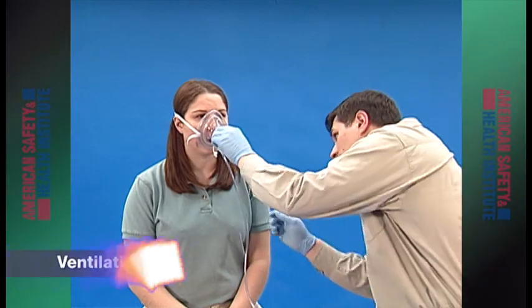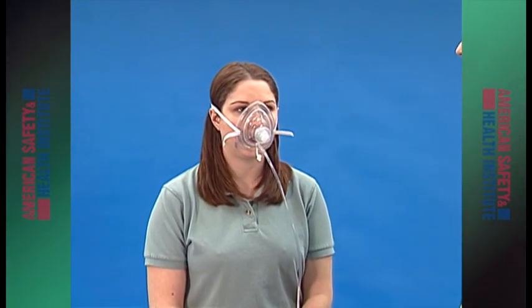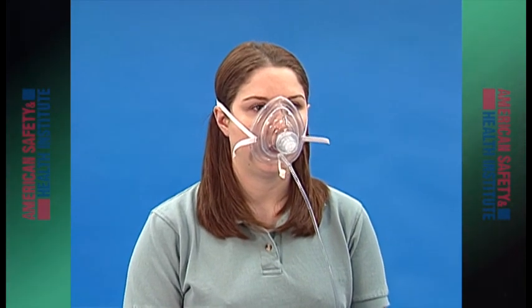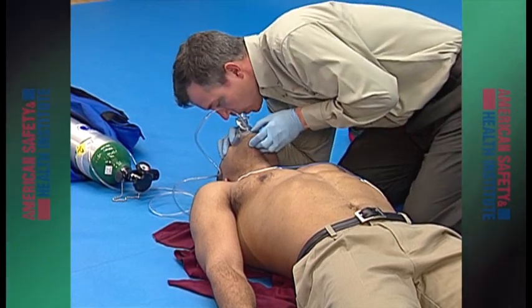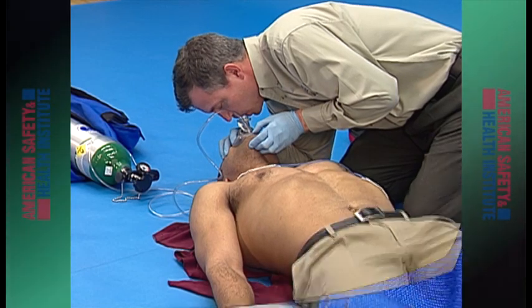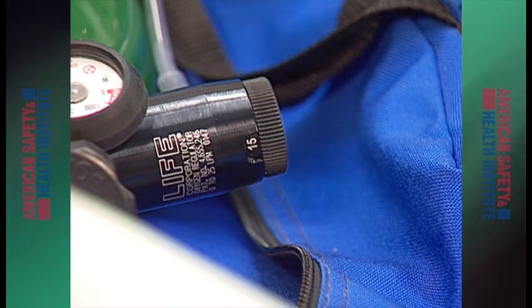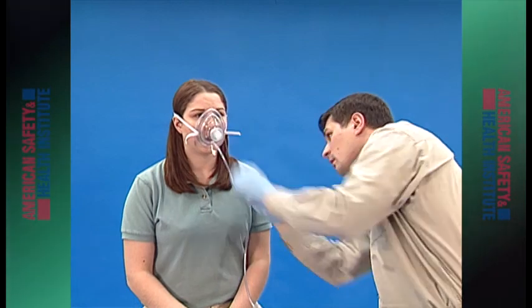A ventilation mask with an oxygen inlet port is a very common delivery device included with emergency oxygen delivery systems. Depending on the flow rate, ventilation masks can deliver oxygen concentrations as high as about 50%. A ventilation mask can also be used on a non-breathing patient by blowing through the port on the top of the mask. Use the highest flow rate available between 6 and 15 liters per minute. Make sure the mask seals well on a patient's face.